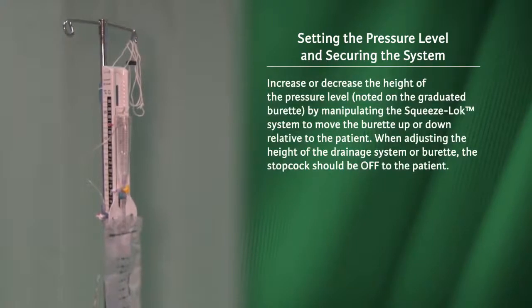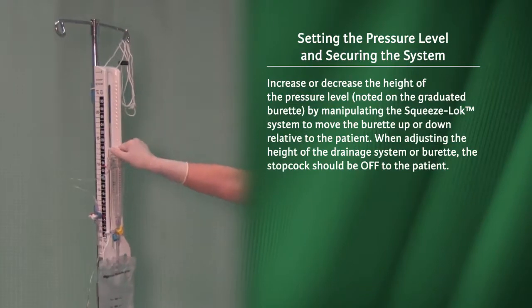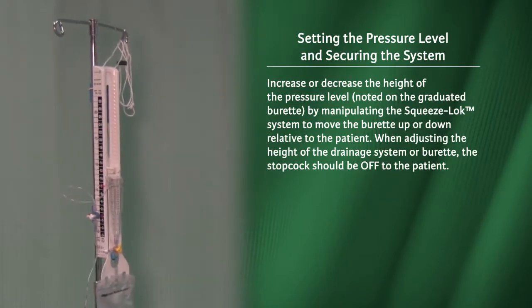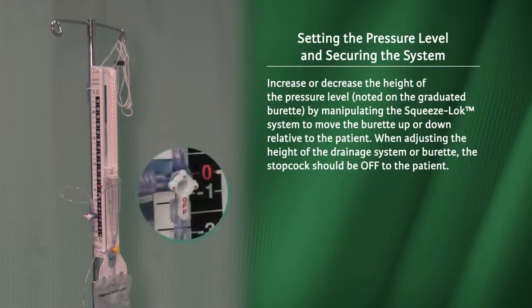Increase or decrease the height of the pressure level noted on the graduated burette by manipulating the squeeze lock system to move the burette up or down relative to the patient. When adjusting the height of the drainage system or burette, the stopcock should be off to the patient.